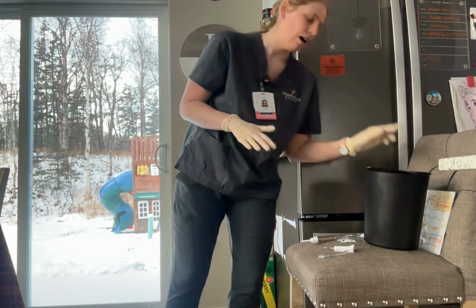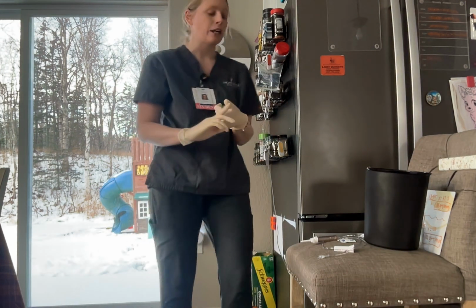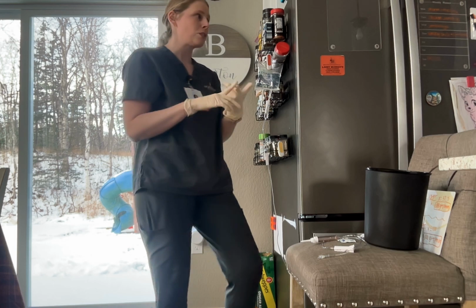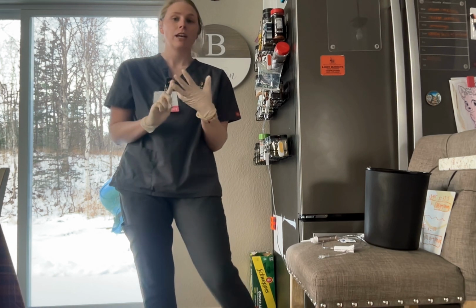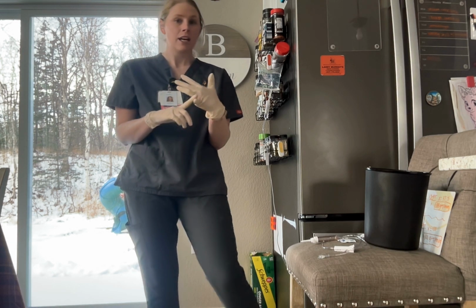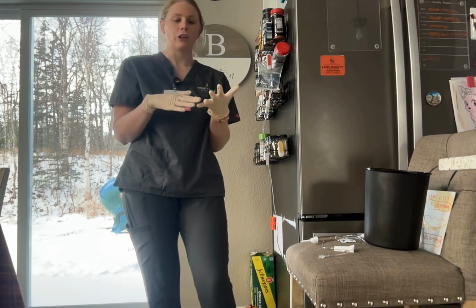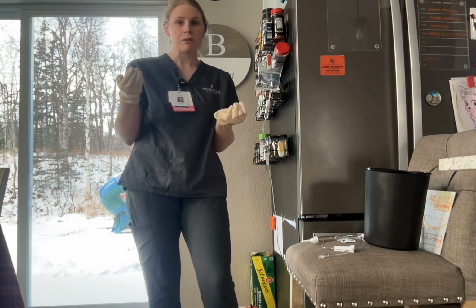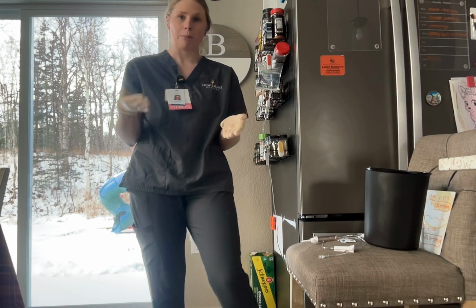Now before I begin, I'm going to go over the 6 rights of medication administration because we are giving the patient an antibiotic. So it's the correct patient, the correct time. It's 3:30 in the afternoon, which is the time that the prescriber has ordered this med for. The correct medication, it's amoxicillin. The correct route is through the IV, and the correct rate is 100 drops per minute, along with the correct dose, 250 milligrams in 100 mLs, which works out to be 100 drops per minute.